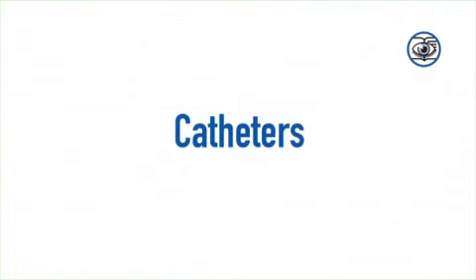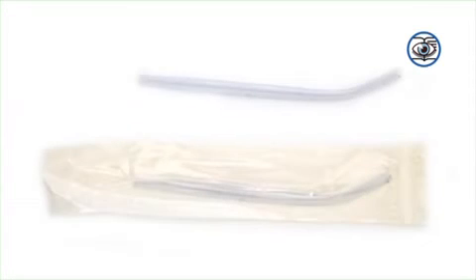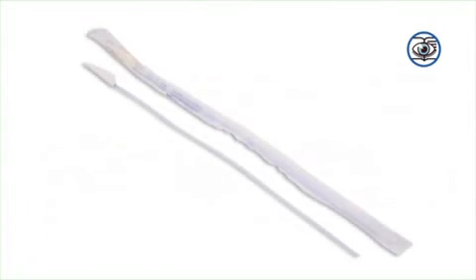The suction line requires connection to a tube or catheter before insertion into the patient's airway. In preparation for this intervention, the CFR must first select the most appropriate catheter type. 1. A rigid or Yankauer catheter, suitable for general use, or a soft tip catheter, usually reserved for more delicate interventions.